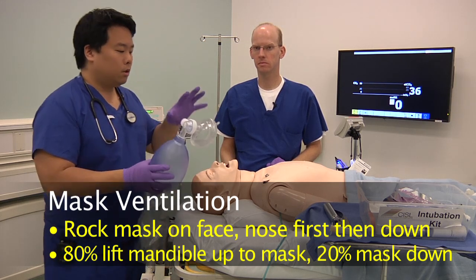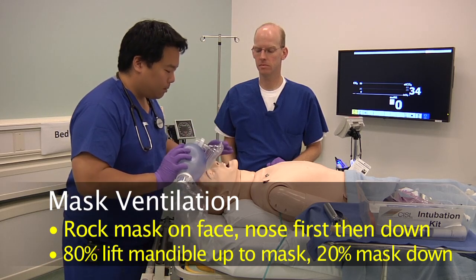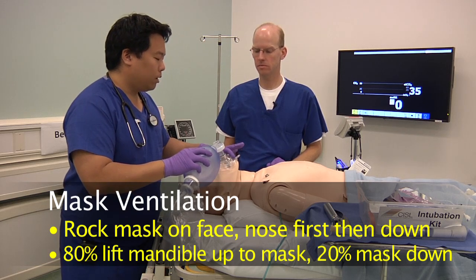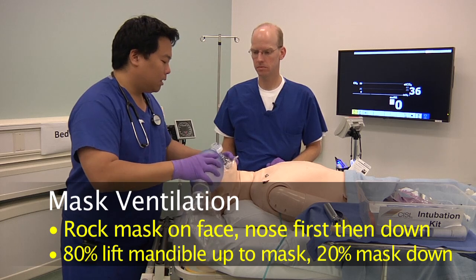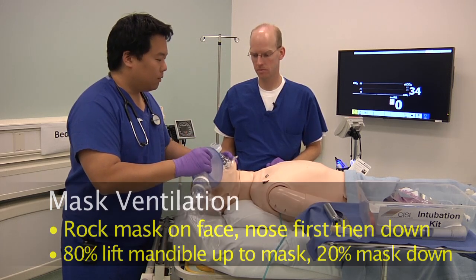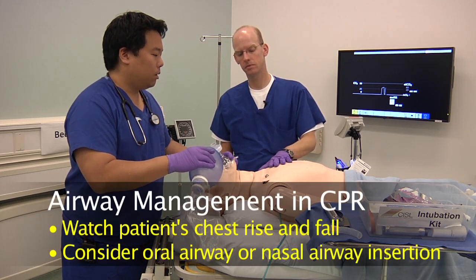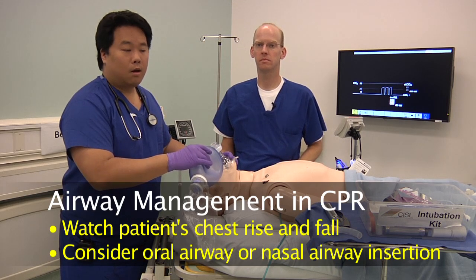So what we want to do here is to apply the mask to the patient's face, starting at the nose and continue down and tilt down. And then with your fingers here, lift up on the jaw and create a seal. And sometimes you might have to rock back and forth to get a good seal. And then you can go ahead and give a breath. And what you want to do is watch the patient's chest rise and fall with each breath so that you are confirming that you can ventilate the patient.